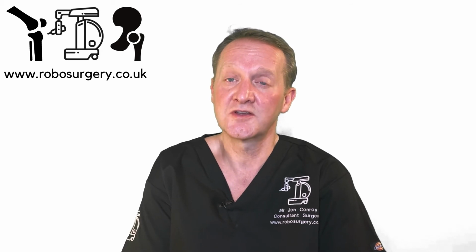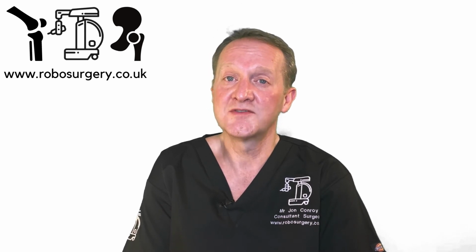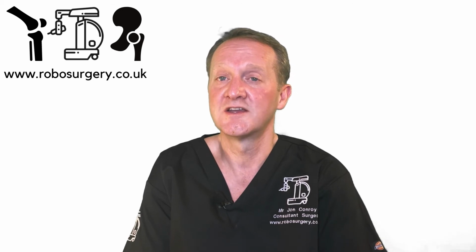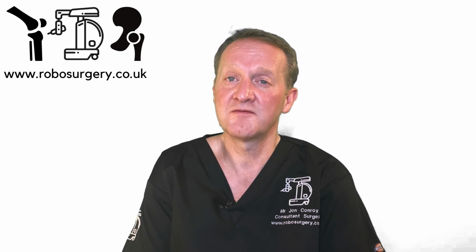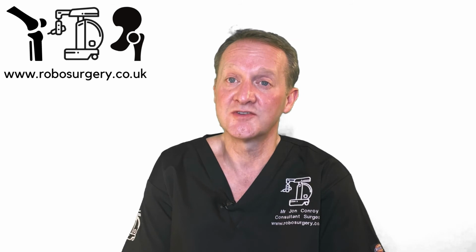So that should overcome the problem of an oversized implant. The malalignment, we have the most accurate system of computerized robotic cutting of the bones. And in the Mako system, compared to other robotic systems, it actually cuts the bone in 3 dimensions.